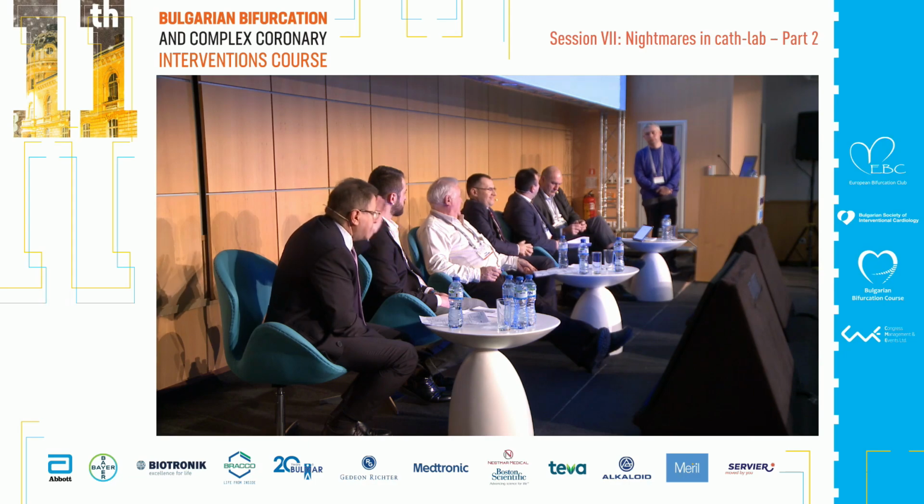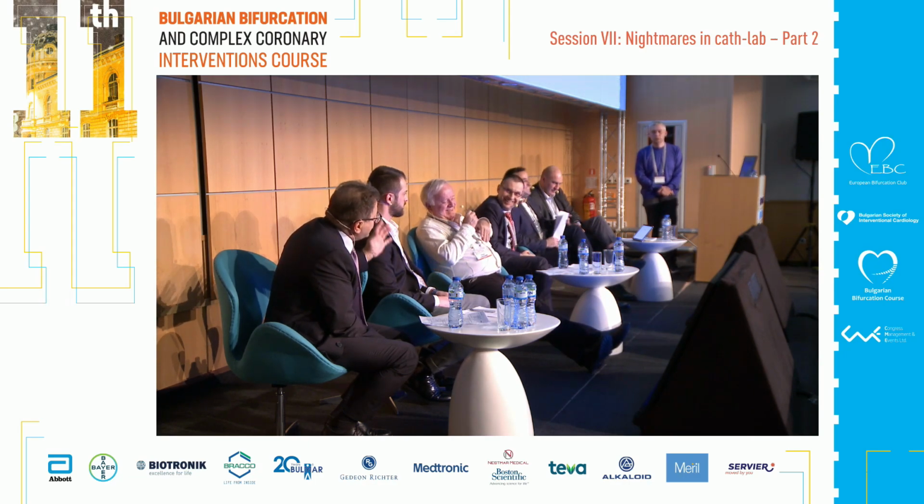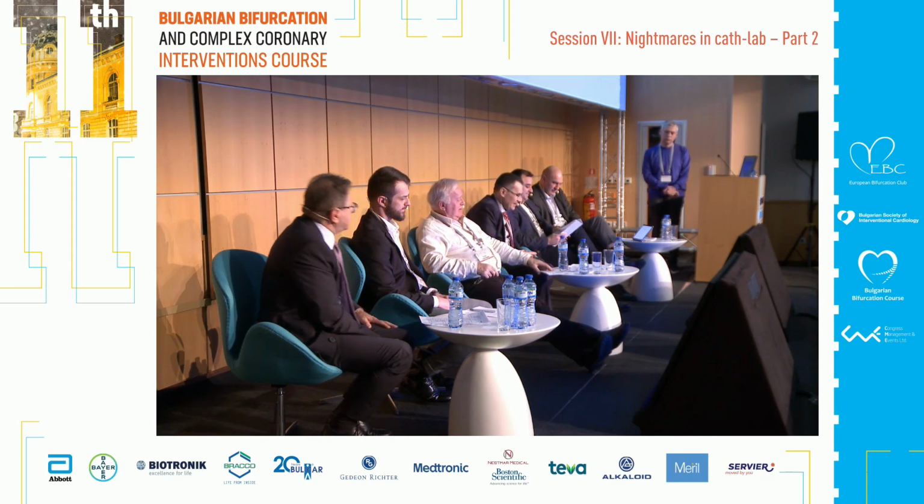The implantation of a second valve is very easy. By the way, it's very expensive also. Yeah. Definitely. Yes, but you know, the patient is the most valuable part of this procedure.